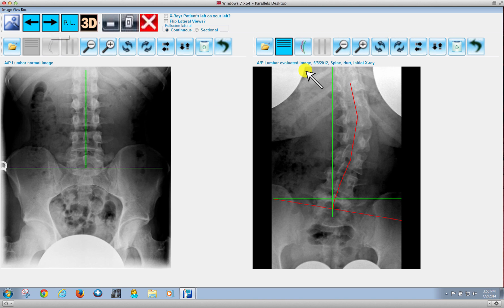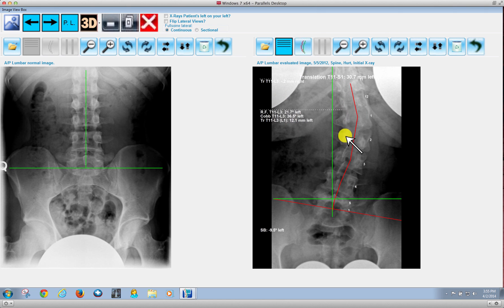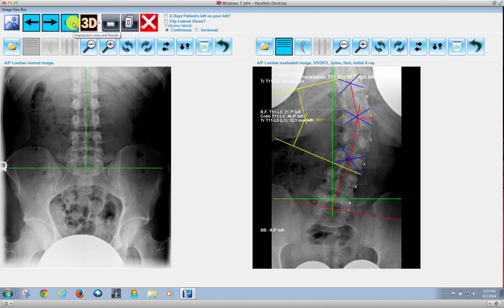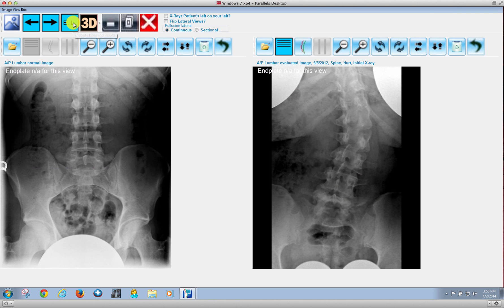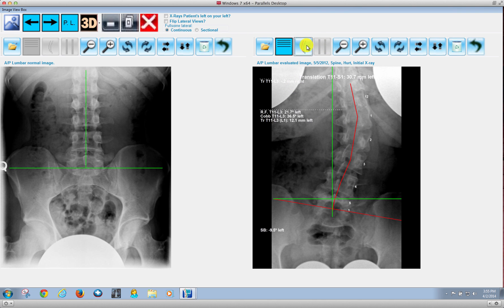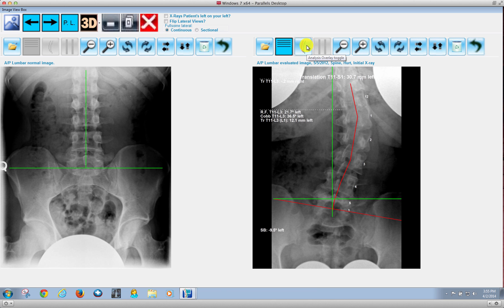Moving on — with scoliosis, the nice thing about this is that if we want to overlay and show Cobb lines, a big request was to be able to do that, so now we can. We can go ahead and toggle on the Cobb lines if we want to. We can also shut them off because the end plate's not there, or we can also hide them.